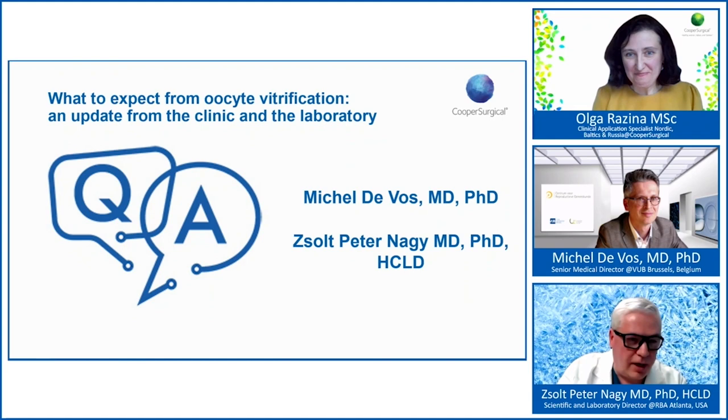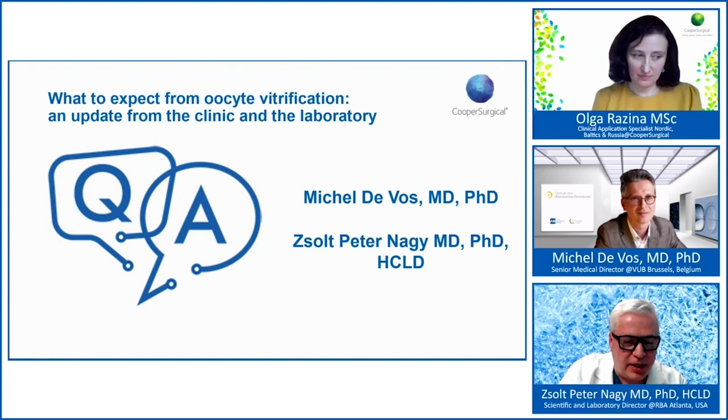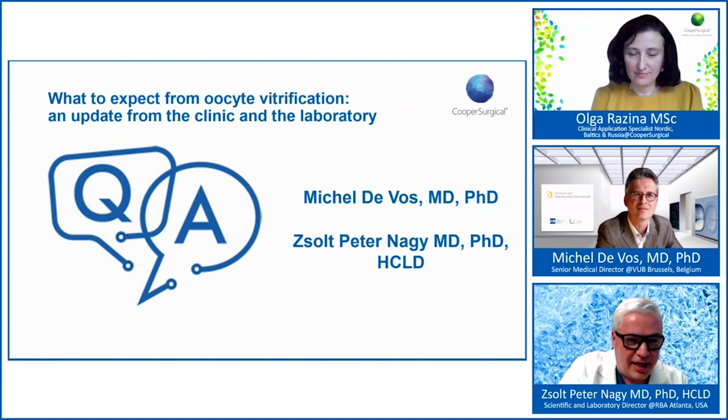Right. So again, if we remove all the cumulus cells, I think you probably have a better chance for a successful vitrification. I don't think it has been studied many different ways. I have also experienced that we can vitrify oocytes with some cumulus and corona cells around it, and it still can be successful. Back at the time when ICSI started in Brussels, we were also thinking about leaving some corona cells around the oocyte, we didn't see a very big difference in terms of outcomes or any benefit. So I cannot really confirm that this is doing anything better for the eggs.